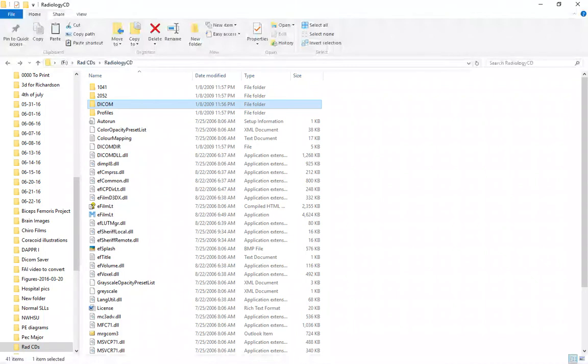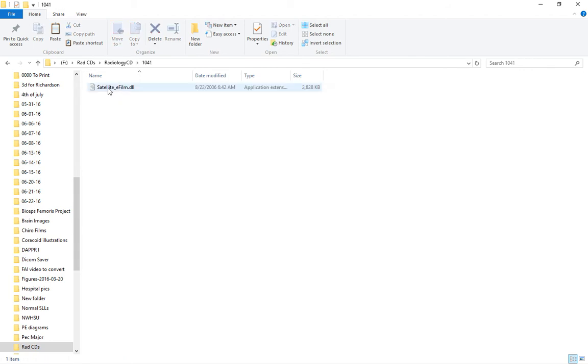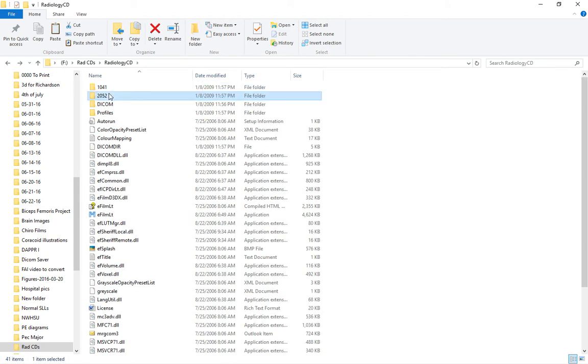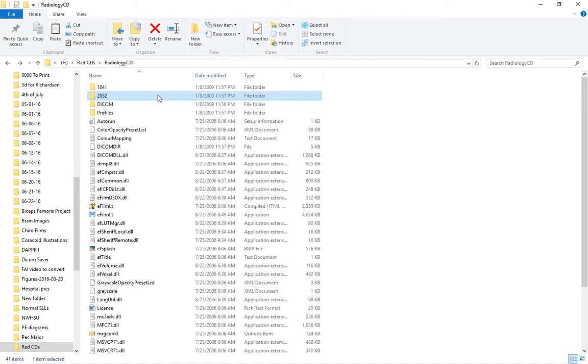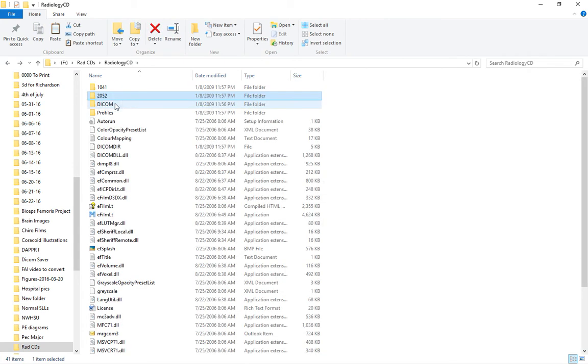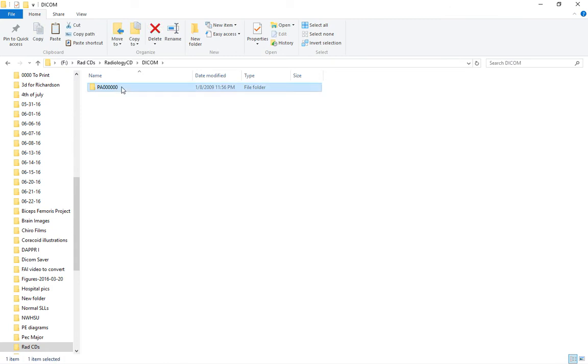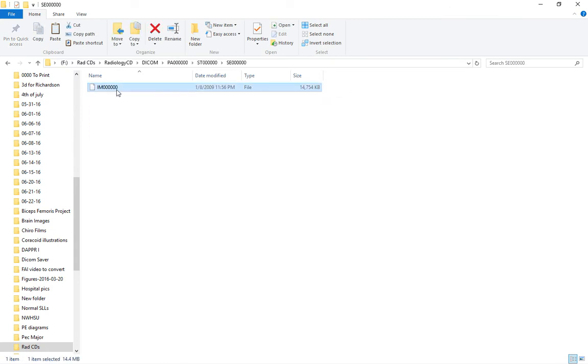That's one scenario. But many times we have multiple folders that are unclearly labeled, so we just have to click through and see. These are all DLL files, so we know they're not the files we're looking for, and they're not quite the right size. They should either be blank files like our DICOM ones or they should be .DCM files.